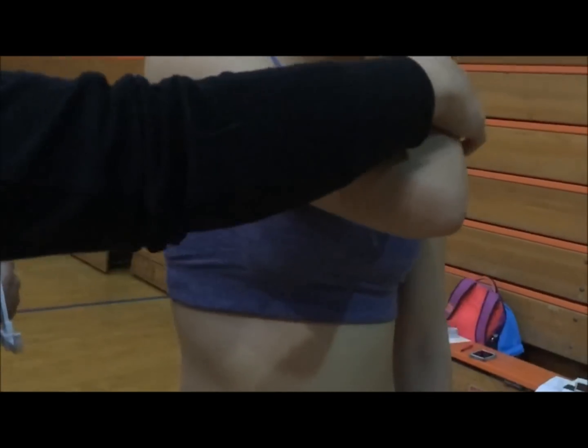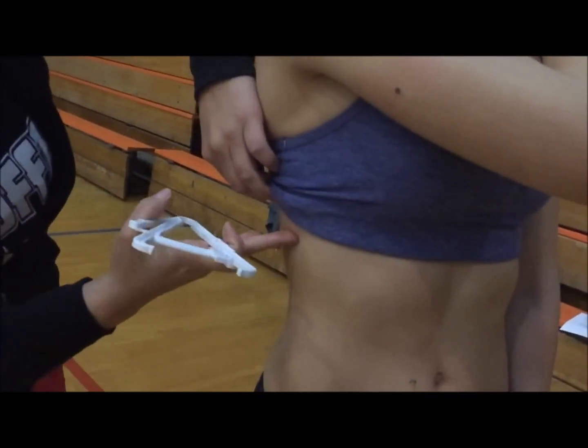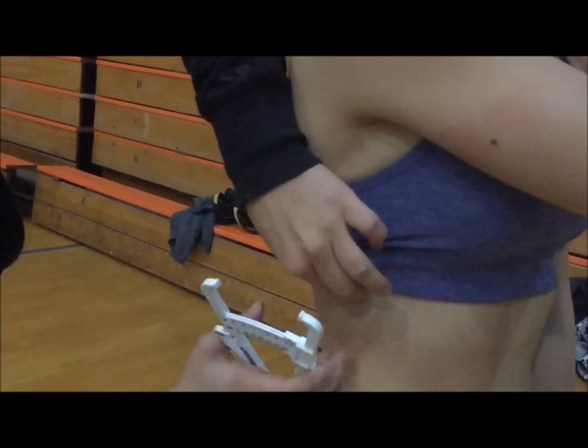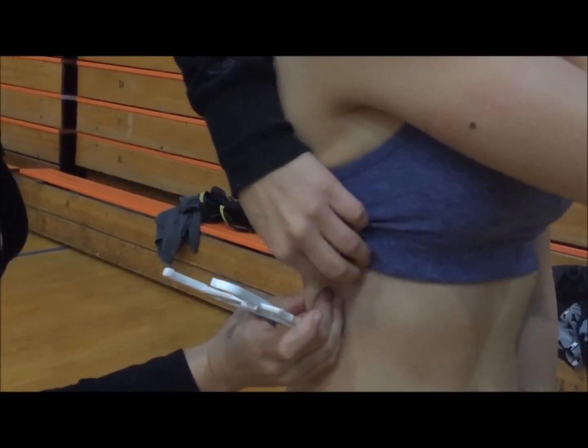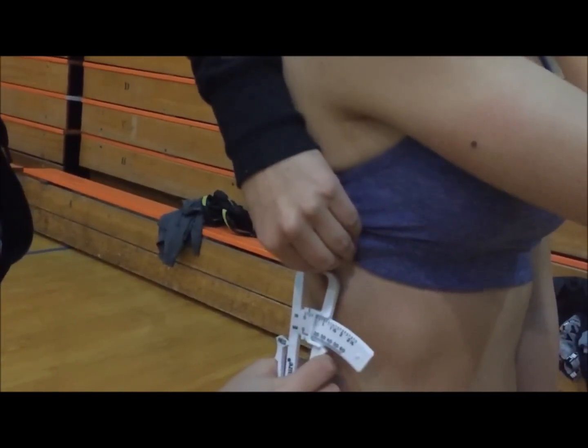Next, we will be doing the mid-axillary. Make sure that you are doing it in the correct place where you have marked and this will be a vertical fold. Pinching away the skin from the muscle and take your measurement.